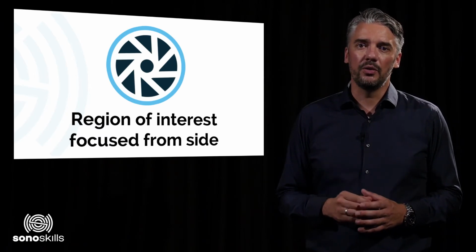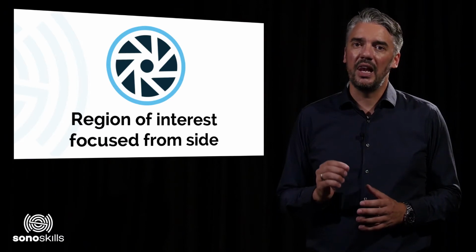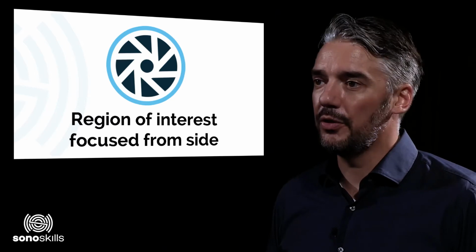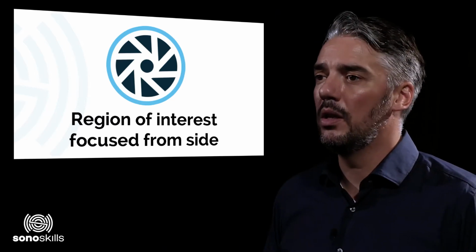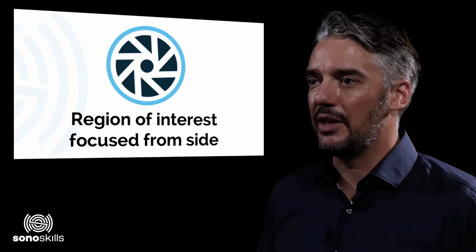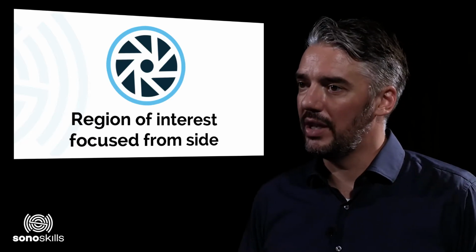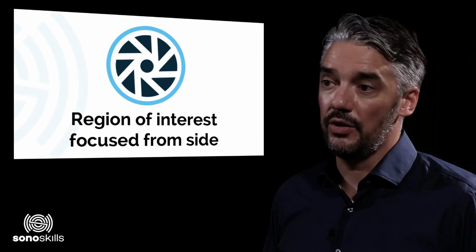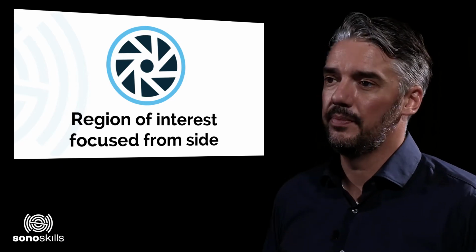Not focusing on the region of interest results in a less clear image. Although it might seem like the difference between focusing and not focusing is small, it has been proven in clinical practice that these small changes are in many cases crucial in deciding whether there is pathology present or not.